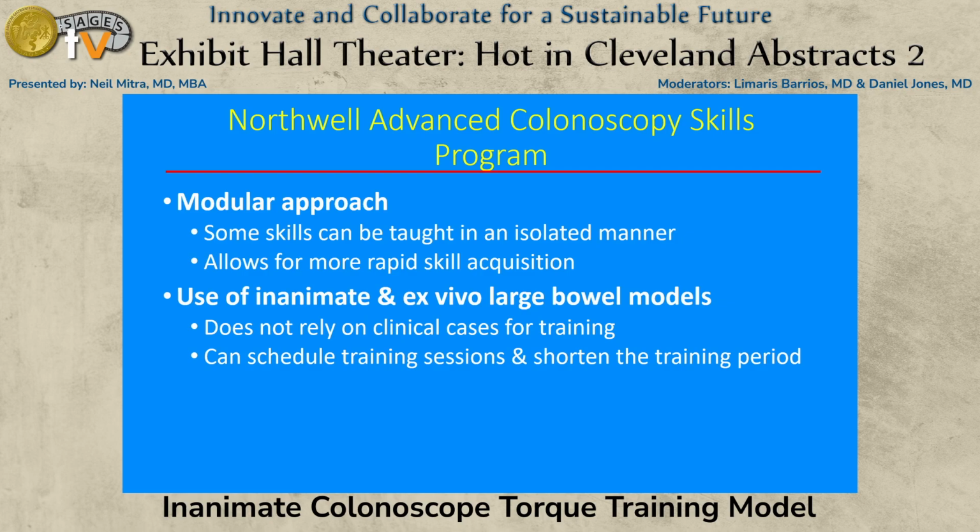The Northwell program embraces a modular approach wherein some skills are taught in a very focused manner. This approach is believed to result in more rapid skill acquisition. The program also includes modules wherein complete ESD cases are done. The training system uses inanimate and ex vivo animal large bowel models only. Therefore, training is not dependent on clinical case volume. This allows for training schedule and timeline to be flexible.